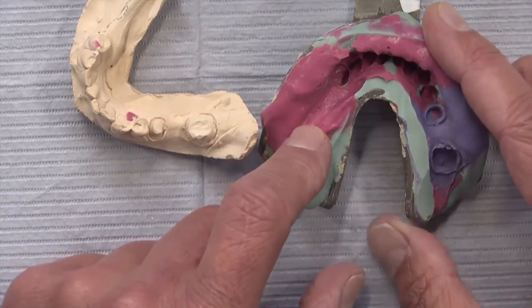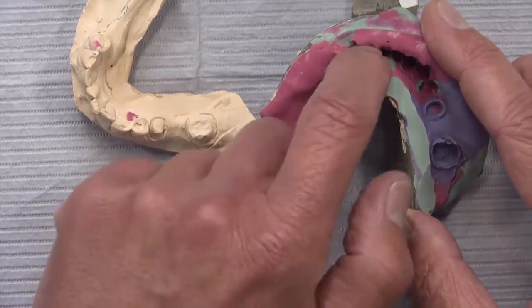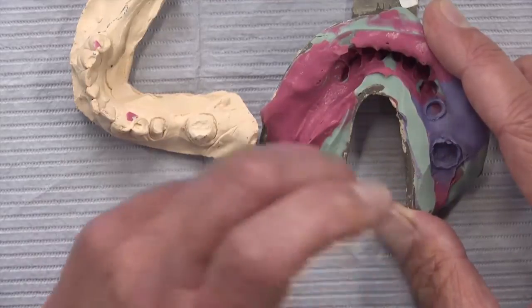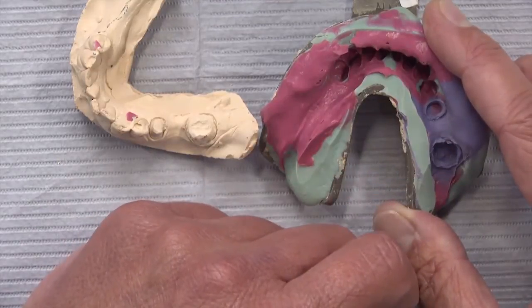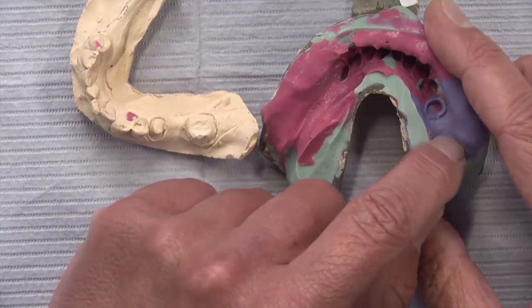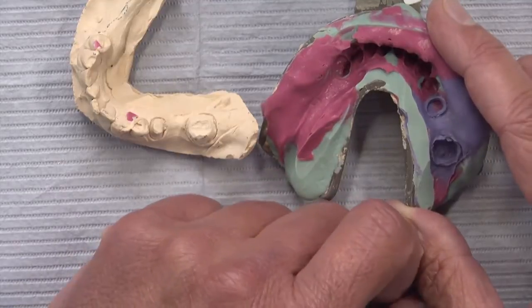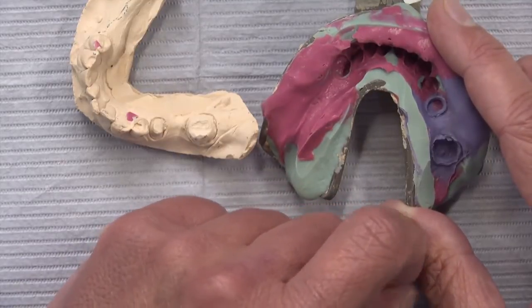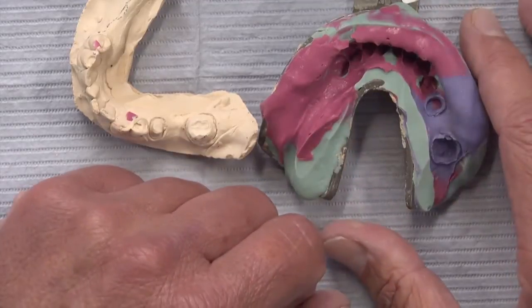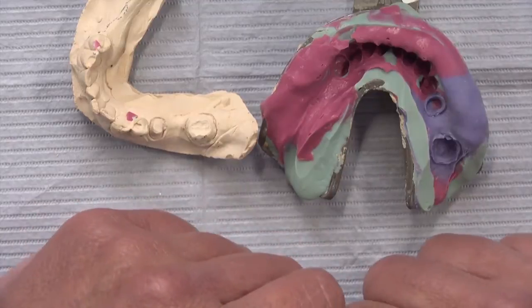And the H&H technique, all you do, you don't hollow anything out. You take an impression, essentially, and then you put more wash material where the prep is and have the patient bite back together again. And so you've got one preparation being represented by this material while the rest has been impressed by the other, and they're setting at different times. And that's really where we kind of run into those issues. And that's why I understand why dentists want to do things without a retraction cord, and that's why we continue to look at other alternatives.